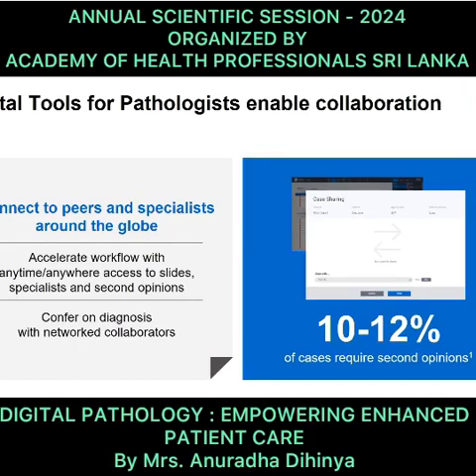What they are doing in this EQAS program is that initially they used to courier the slides to all the participants. When they used to courier, it used to take a longer time, and on top of it, the slides also used to break. Now they have gone ahead with the digital scanner, and for the last 5 years they have been running this digital EQAS program, where they have also increased the number of participants. With the earlier program, it used to take somewhere around 2 to 3 months to complete one cycle of the EQAS program.